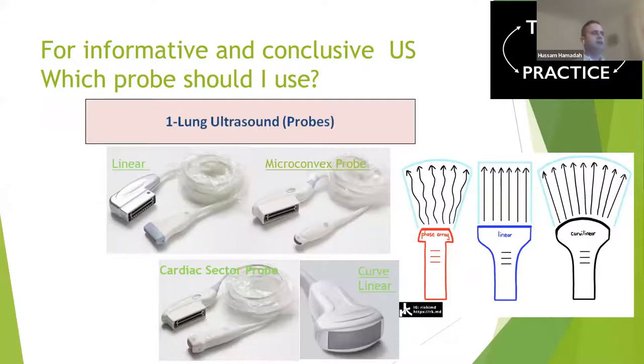When we go to the ultrasound machine, the first question that will come to our mind is, which probe should I use? In general, try to mix the probes. Use the linear probe and microconvex probe for diagnostic issues. Use the cardiosector probe for cardiac related problems. And use the linear probe for ultrasound guided procedures like central line insertion or pigtail insertion.